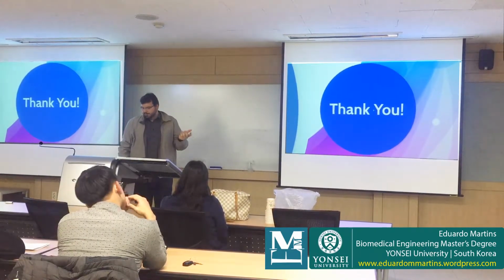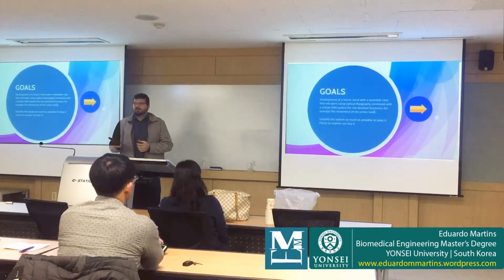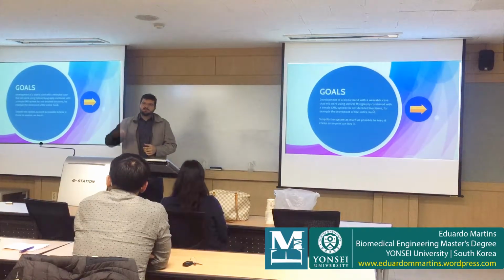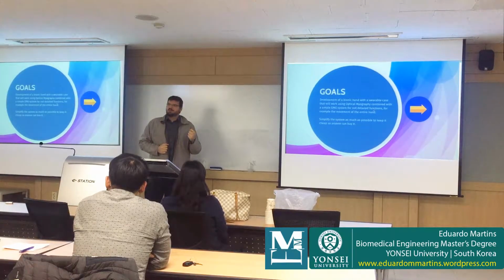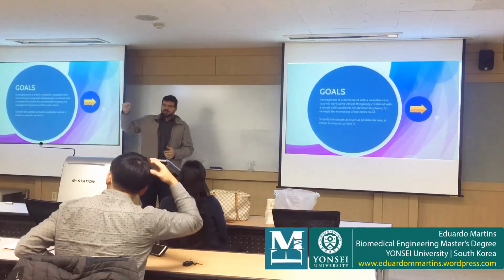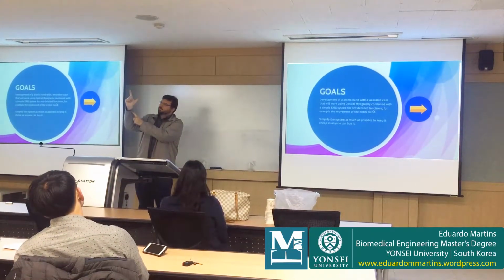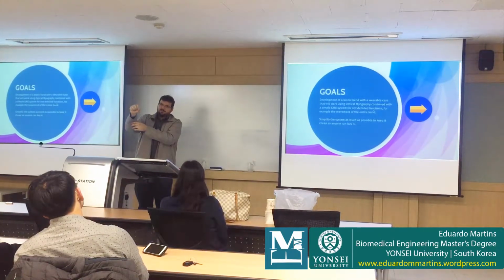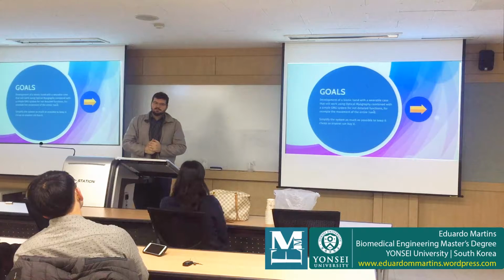So the main purpose of this project is to simplify the system, so you can get it very fast and with independent finger movements. Because the last bionic hand I saw costs about $30,000 and doesn't have independent finger movements. Sometimes to pinch, they just set a button, and these fingers will do like this. When you move the muscle, they recognize the signal, but they only do this for pinching something. So this is an easier way to get independent finger movements.